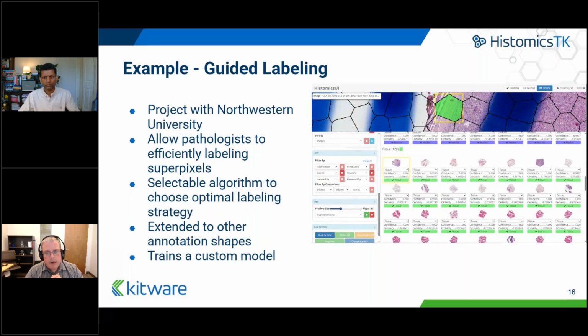So we divided the image into superpixels, just large regions that try to have some of these regional boundaries land on image features. For training this and letting our engineers work on it who are not biologists, we said, let me just take some simple examples where I was differentiating between tissue and the markers where a pathologist has written something on the slide, or the background. But in reality, this is being done by a placental pathologist who has 12 or more types of villi that he's distinguishing and wants to do that.